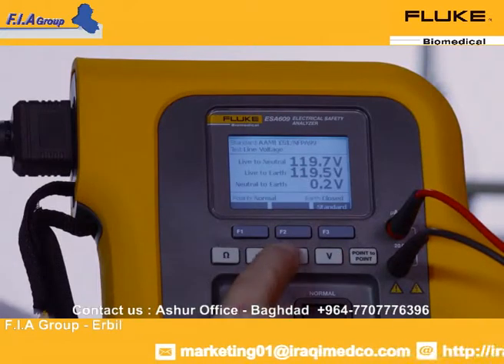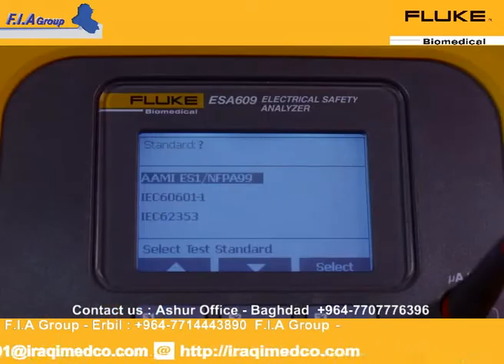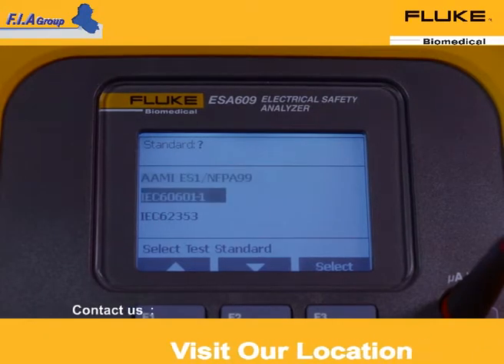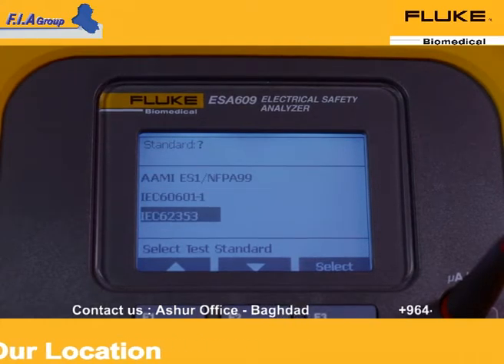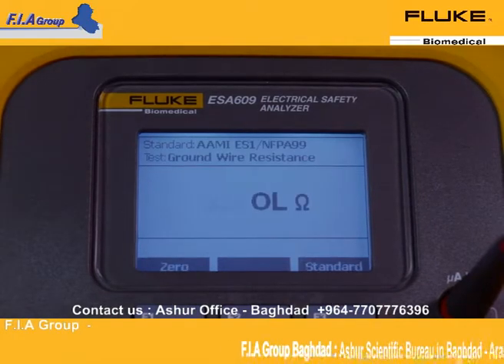Notice how fast the ESA-609 cycles between tests, making it possible for basic testing in minutes. Versatile to global electrical safety standards, the ESA-609 tests to IEC-60601-1, IEC-62353, and ANSI-AAMI-ES1/NFPA99.